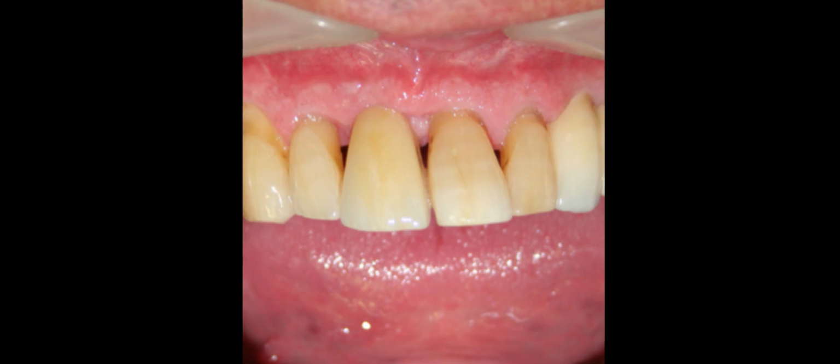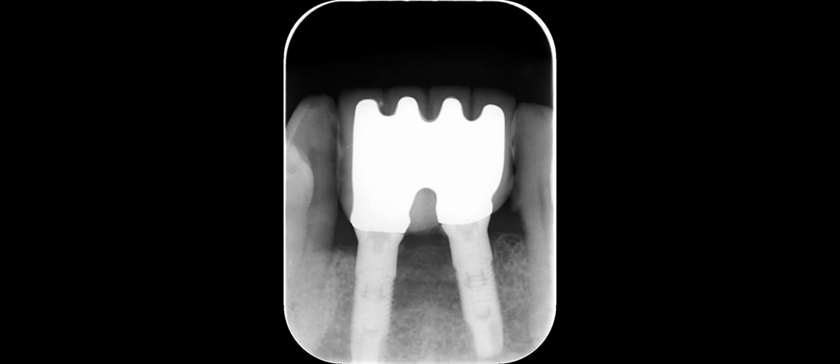The implants are looking good. Over here you see this is an implant, part of an implant bridge, and the gums are looking quite good there as well, considering he hadn't been anywhere to be maintained and looked after properly over the last 7 years. And his lower teeth, the lower implants are actually 18 years this June, so quite a significant milestone there.